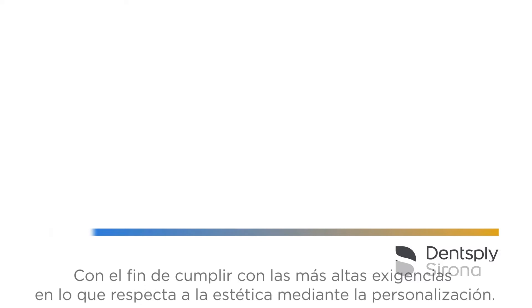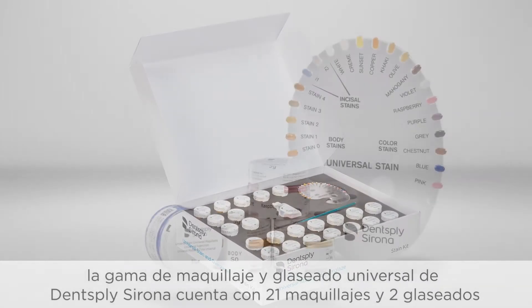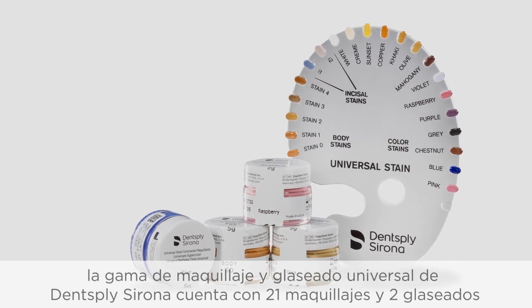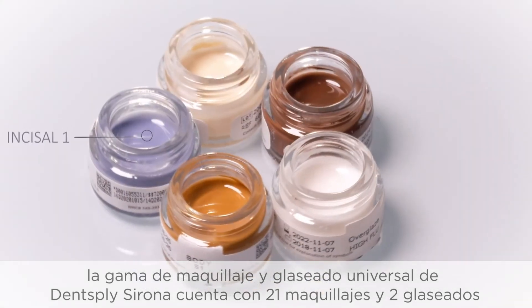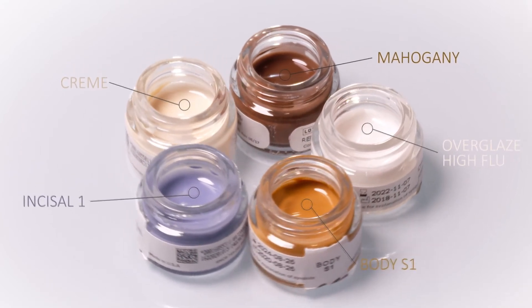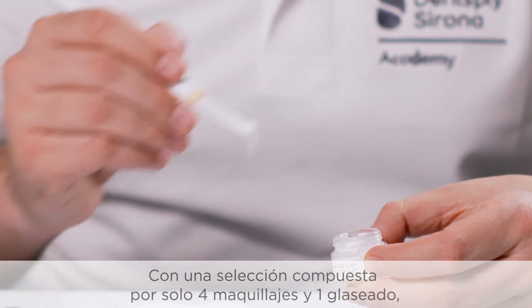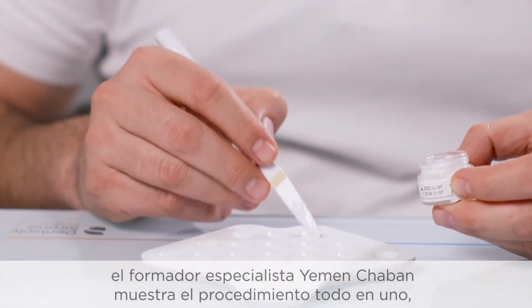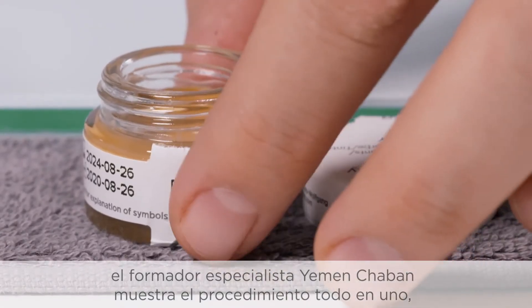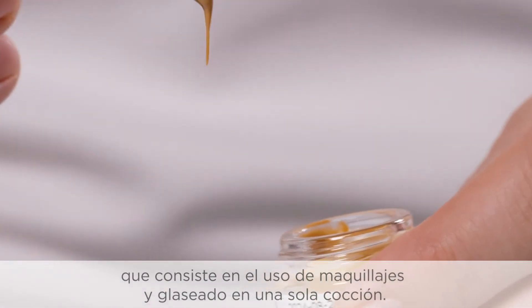For the highest aesthetic demands through individual characterization, 21 stains and two glazes are available in the Dentsply Sirona Universal Stain and Glaze range. With a selection of only four stains and one glaze, education specialist Yemen Shaban demonstrates the all-in-one procedure, which is the use of stains and glaze in one firing.